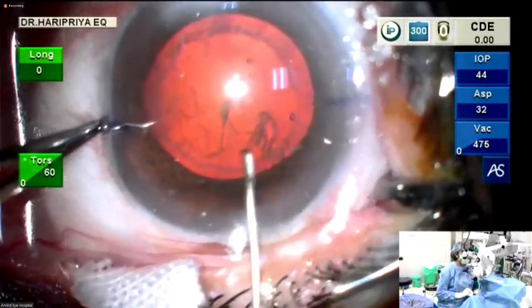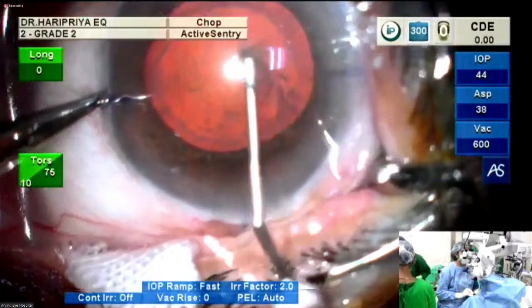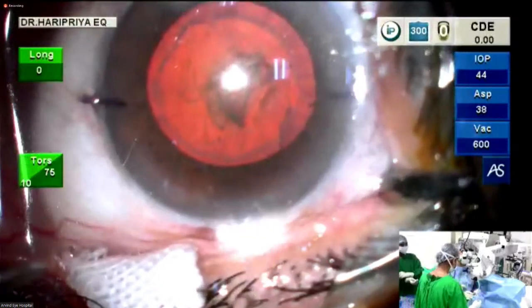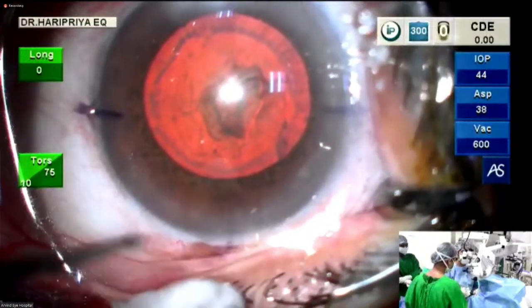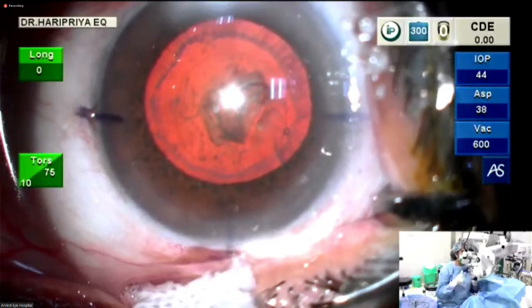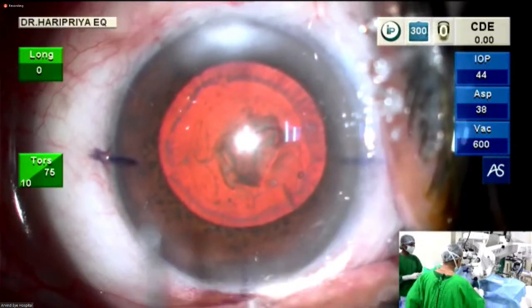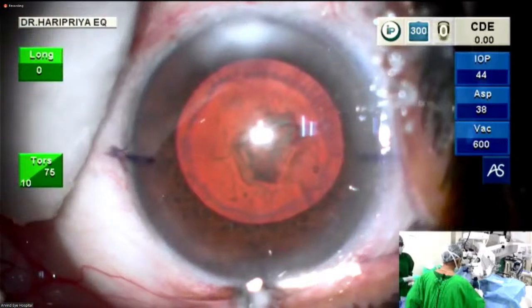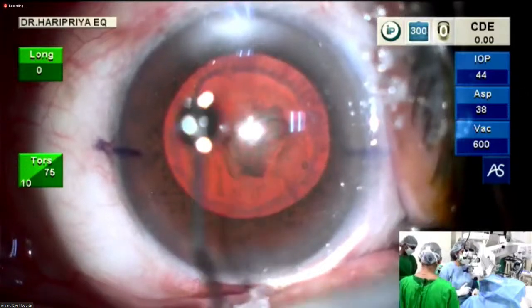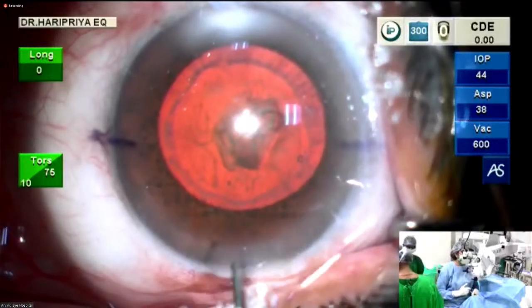So the capsular rhexis is then created. Just one question, Haripriya: if there is a pseudoexfoliation ring, like in this case, you completely avoided it. But if it was more central in location, would you encompass it, or avoid it, or doesn't it matter? Please say that again, ma'am, I didn't get the question. There's a ring of pseudoexfoliation, and in this case the capsular rhexis was inside the ring. Yes, if it were within the rhexis, I think it wouldn't matter. I would go over it. Okay. Here, because it is more in the periphery, the rhexis is smaller.